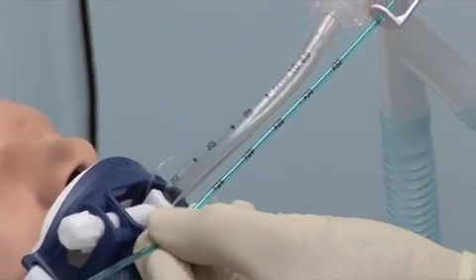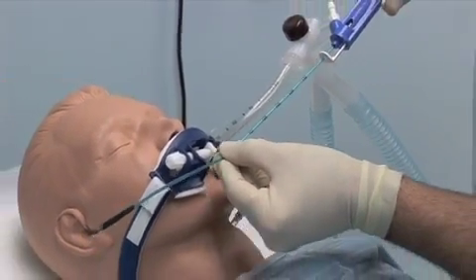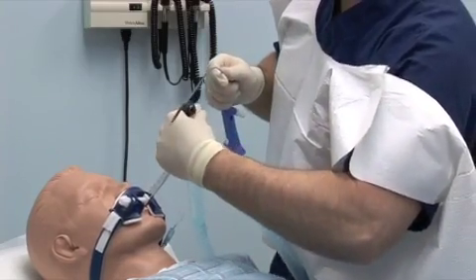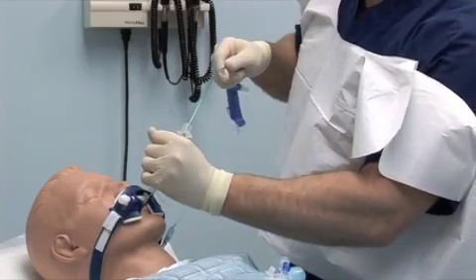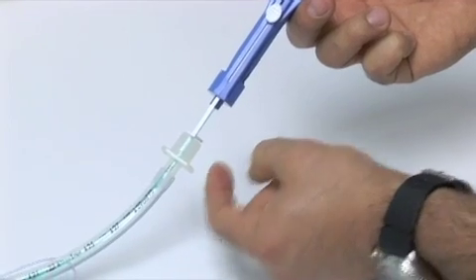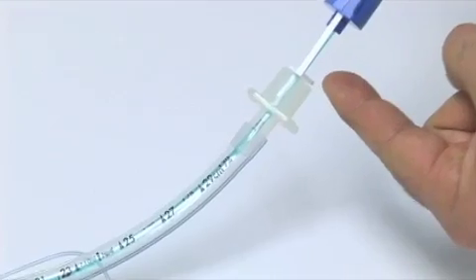Ensure that the CAM Rescue Cath has been properly calibrated to the patient's endotracheal tube. Maintain the suction port open. Disconnect the ventilator circuit tubing from the endotracheal tube. Advance the CAM Rescue Cath into the endotracheal tube until the numbered markers on the CAM Rescue Cath align numerically with the markers on the endotracheal tube and the depth calibrator disc abuts the top of the endotracheal tube.